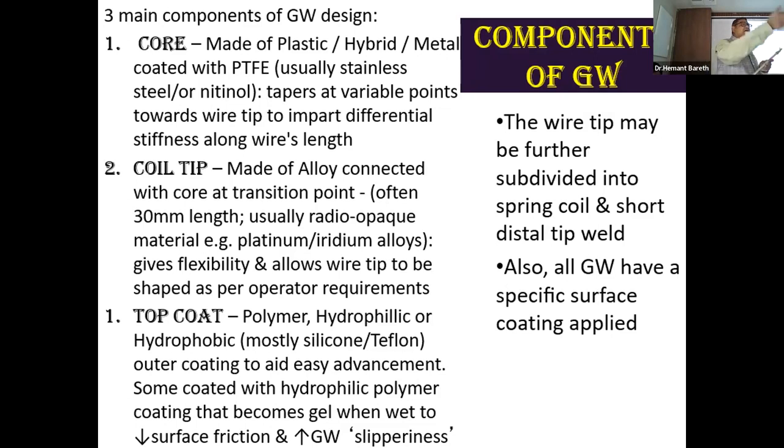And so you can negotiate the long distances of the vessels also. So if you are doing a distal lesion, a hydrophilic wire will help because it will have less resistance. It will help negotiate side branches. It will help negotiate tortuosities.